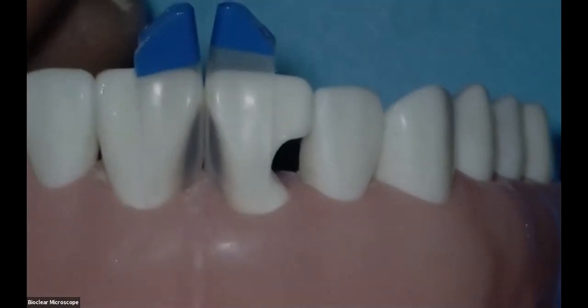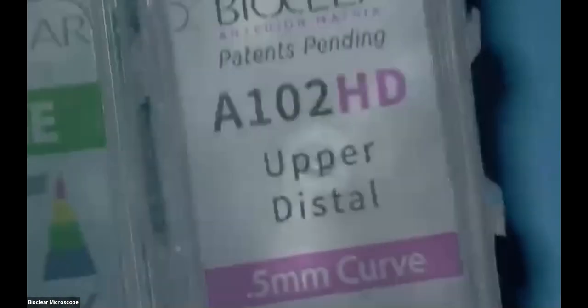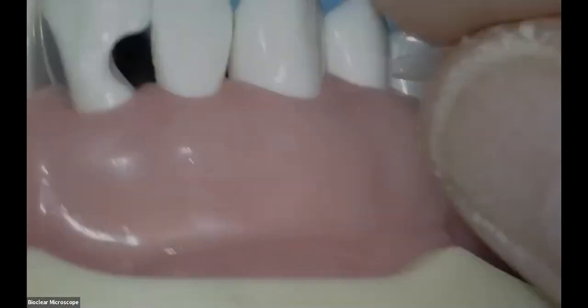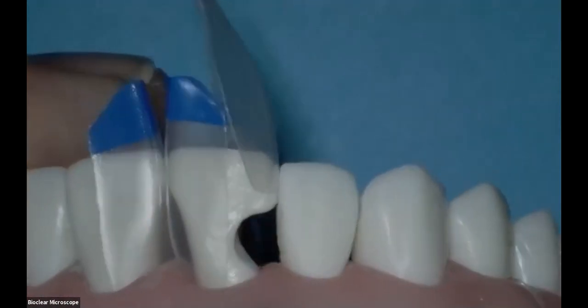Now on the distal, I'm going to be using classic Bioclear. So this is the A102. It's a very curvy matrix. This is from the original Bioclear kit, and I'm going to be using it in the HD. So I'm giving everyone a chance to see two different types of matrices. This is classic Bioclear. You could use this for black triangles, but the black triangle matrix is a lot easier to use. So this is for standard fillings, right? Standard restorations. I'm going to slide the matrix down. I'm fighting the matrix.